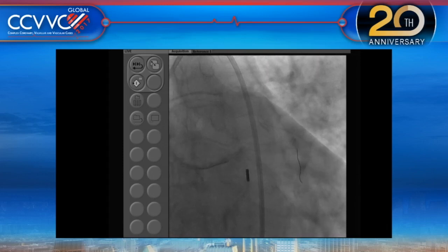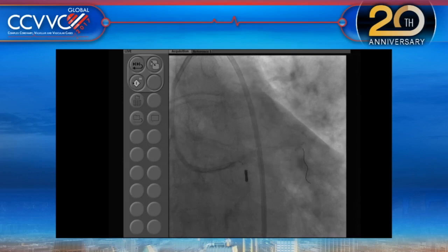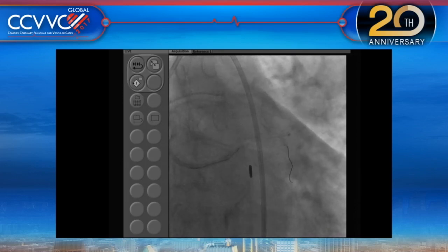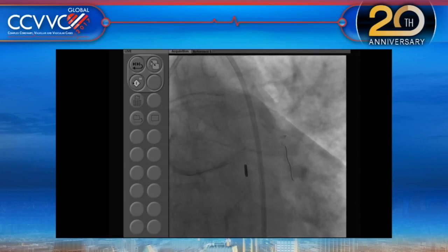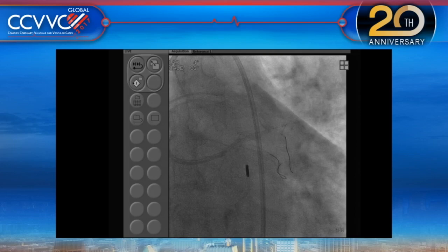You used to do a lot of kissing stents in the left main. You're not doing that anymore? Not with the older generation, which used to be Cypher, Taxus, thicker strut stent, that was very easy. With this newer generation stent, I think SKS would be much harder. So what I did, I came back, I was able to recross it. Now here we may have trouble compared to the first left main where I showed that we'll go with the NC balloon. I'm sure I'll have trouble going directly with the NC balloon to the circ. So we will go with the 2.0 compliant balloon.